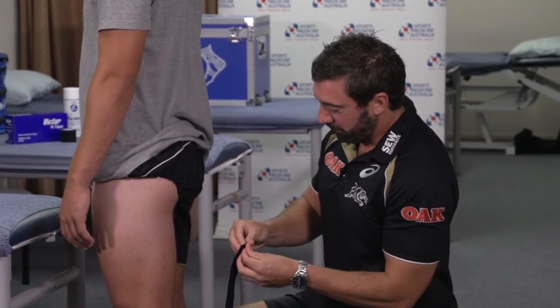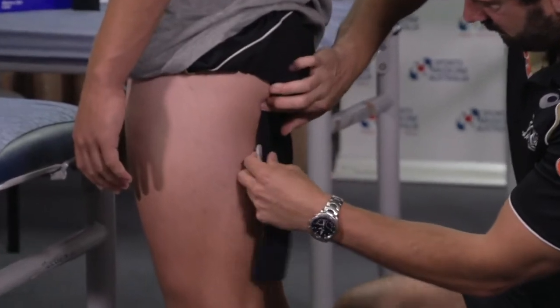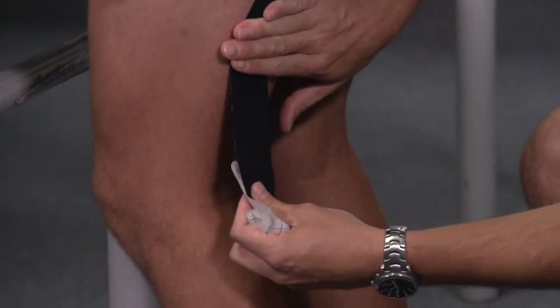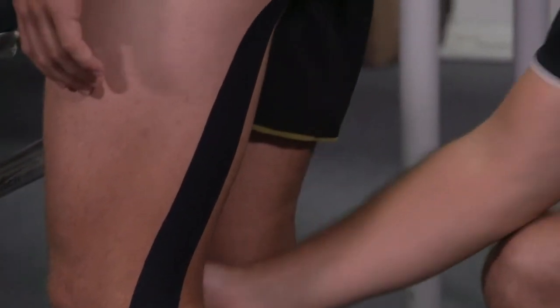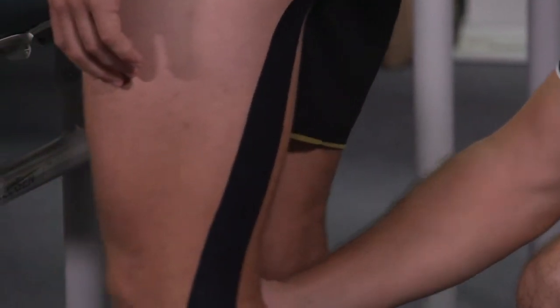So standing up, his glutes not stretched. Again, the origin. It's going to come down a little bit. Now I'm going to get Jack to bend his knee. So his hamstring's kind of shortening, down, a little bit of stretch onto the insertion. You can see as his tape stretches, it shortens. So you're just getting a little bit of recoil.